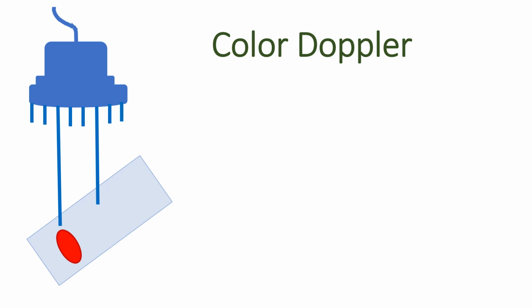Creation of a real-time color image using Doppler shift analysis requires computer power that far exceeds existing ultrasound systems. Instead, color images are constructed not by measuring the Doppler shift, but using an autocorrelation technique. Consecutive sound pulses are transmitted into the same sample volume.